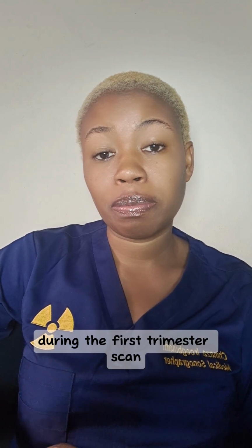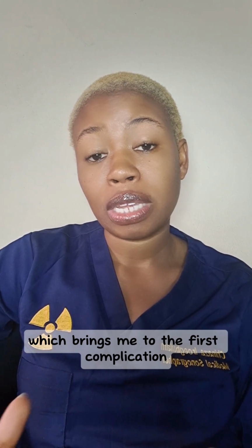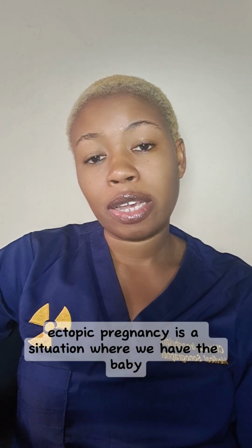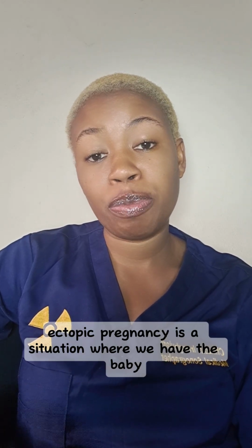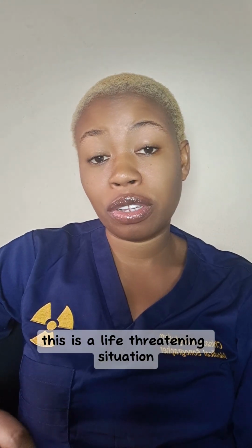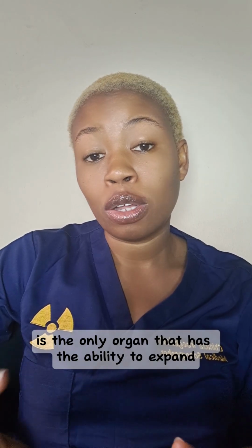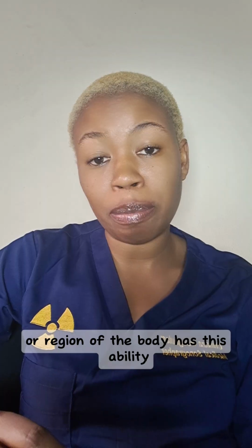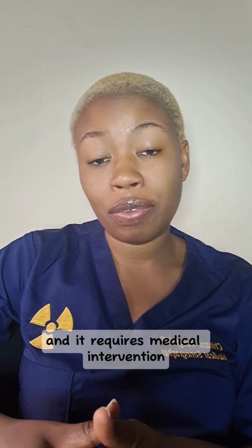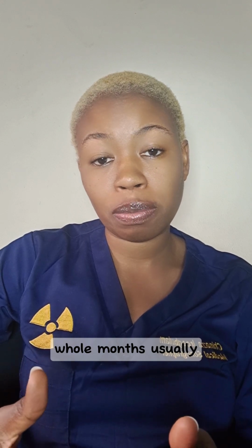During the first trimester scan, the two big questions we answer are the location of the baby and the viability, which brings me to the first complication, that is ectopic pregnancy. Ectopic pregnancy is a situation where we have the baby growing outside the womb, usually in the fallopian tubes. This is a life-threatening situation because the womb is the only organ that has the ability to expand to accommodate a baby for 9 months. No other location or region of the body has this ability, and it requires medical intervention because that part of the body cannot accommodate the baby for 9 whole months.